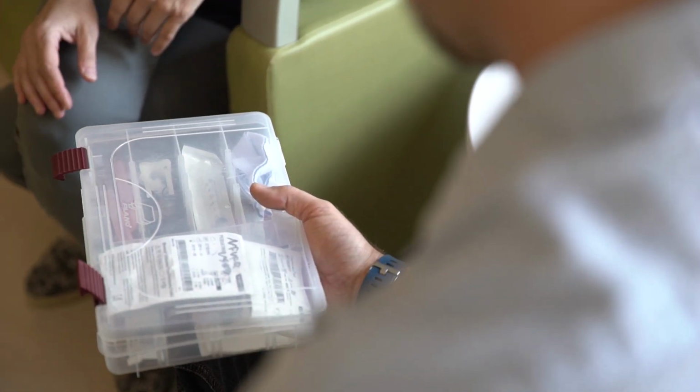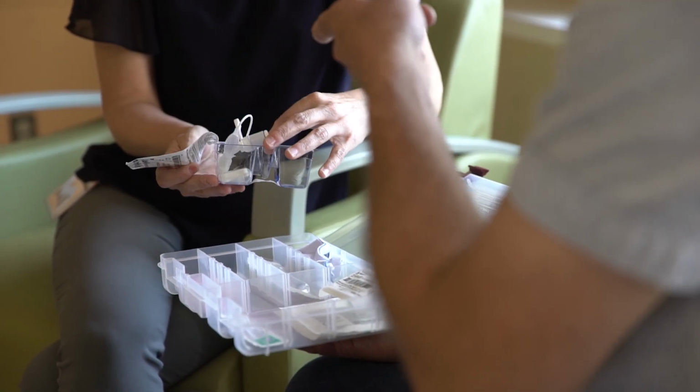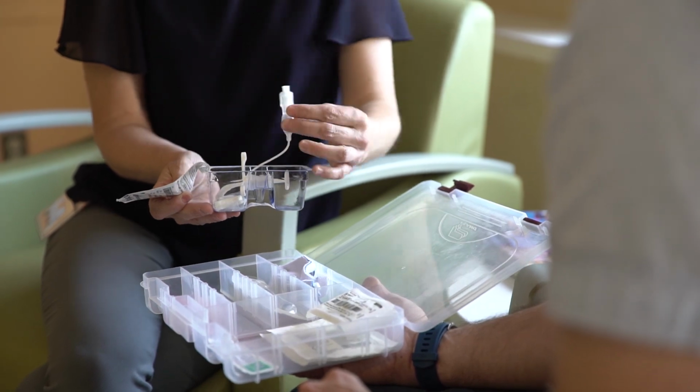If I can have a piece of equipment that's light enough and portable enough, which contains all of the gear, and everybody knows where the pieces of equipment are, then there's no anxiety in pulling together gear in an emergency situation. I settled on this tackle box because I had compartmentalized trays, and I could set up everything for a trach change in that one tray.